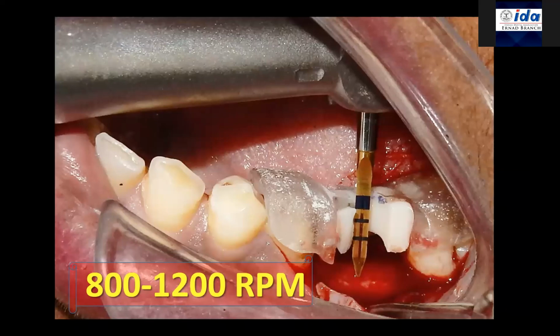Okay, fine. So with regard to this RPM, with a micromotor we cannot generate it. It will simply get stuck in bone. So basically, the problem with a micromotor is that if you were to use it at 800 to 1200 RPM for making an osteotomy, it will get stuck in bone.